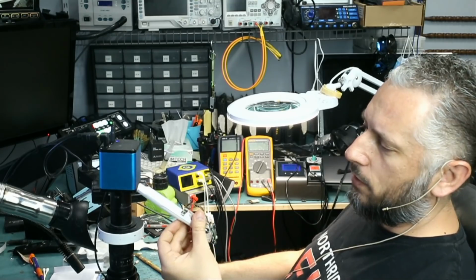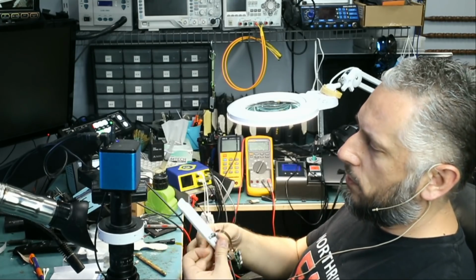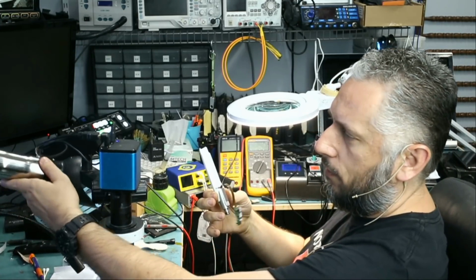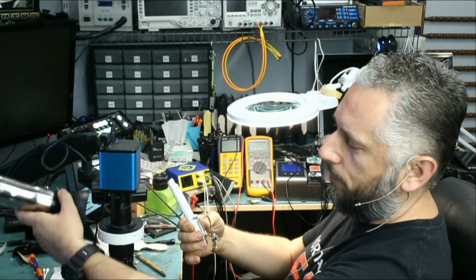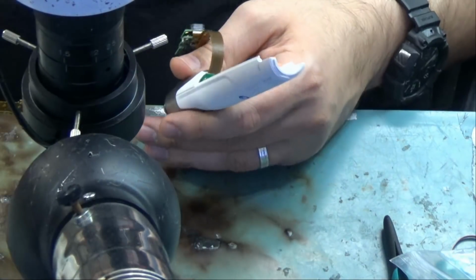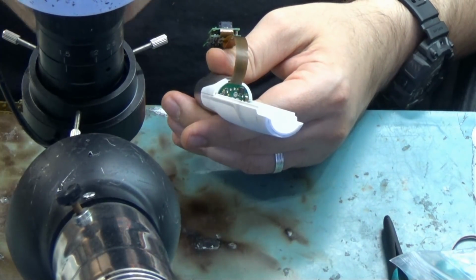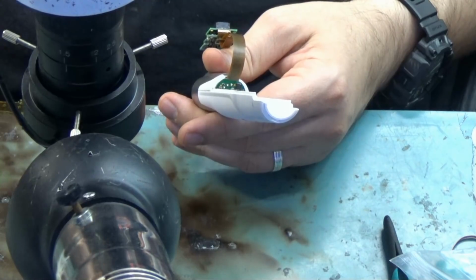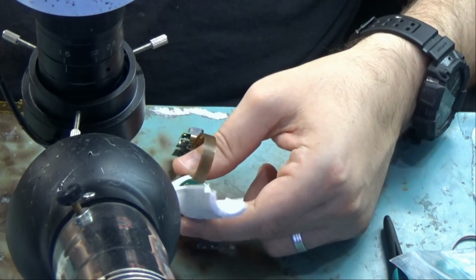I'm gonna tilt the board under the microscope at a 45-degree angle so we can see it, and then maybe I'll use the fume extractor, the one that you see here, to hold it from the back so it does not fall down. Right, so let's see. This is an expensive tool, about $1,300. So it's a delicate device, and we have to do this as precise as possible. Okay, so we're gonna tilt the board like this.